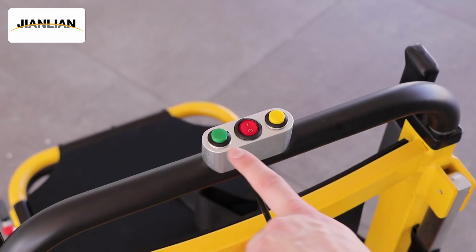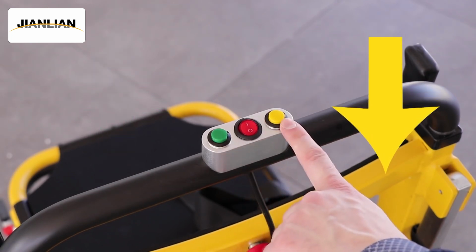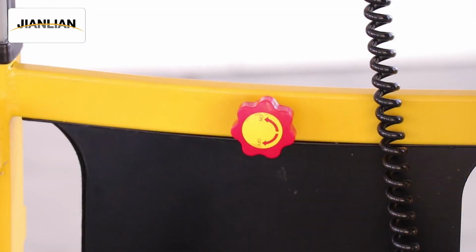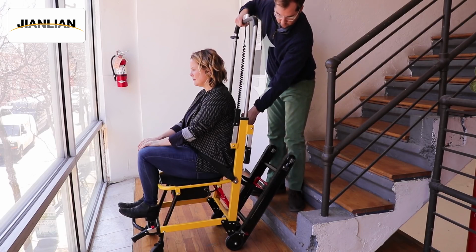The red switch sits between the green button, which rotates the treads to take the stairlift up the stairs, and the yellow button, which rotates the treads to take the stairlift down the stairs. Rotate the red knob on the back of the stairlift to extend the handlebar. We recommend that you completely extend the handlebar to its highest level before beginning your ascent or descent.